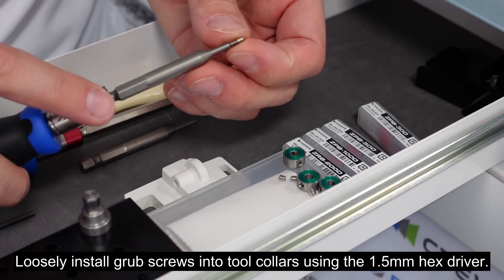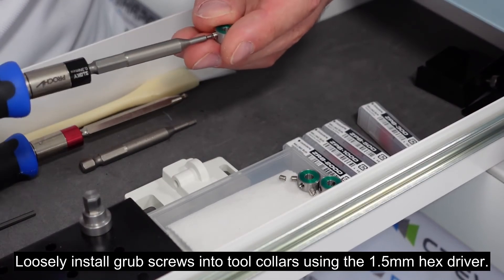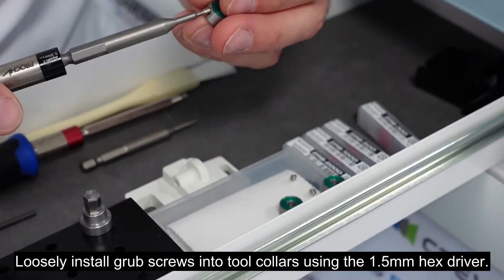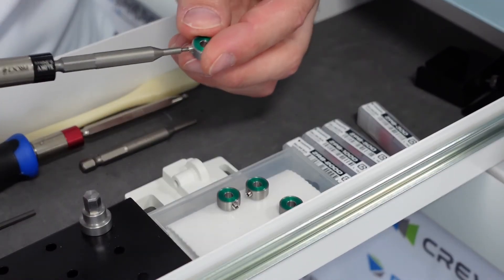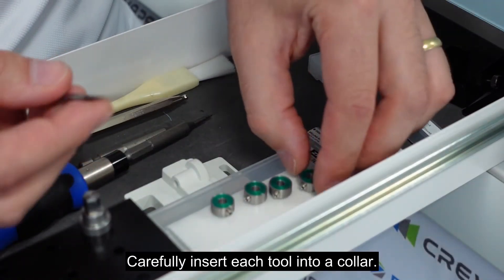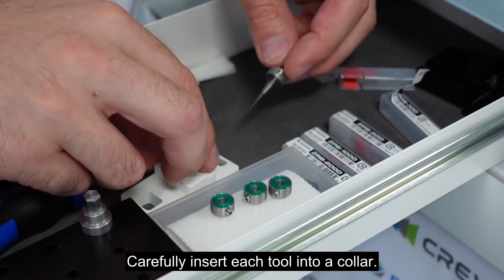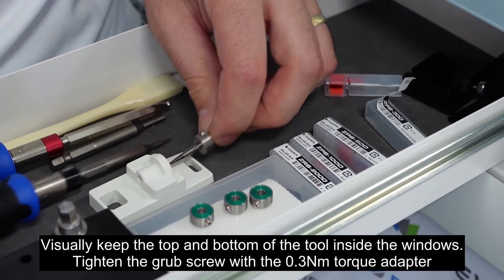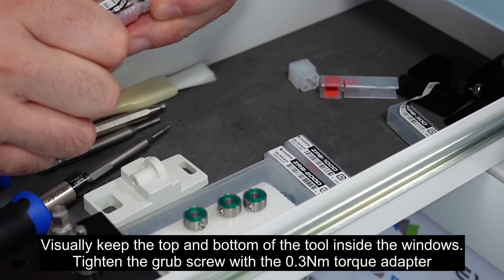Loosely install grub screws into tool collars using the 1.5 mm hex driver. Use the tool positioning jig as shown, visually keeping the top and bottom of the tool inside the windows. Tighten the grub screw with the 0.3 Nm torque adapter.